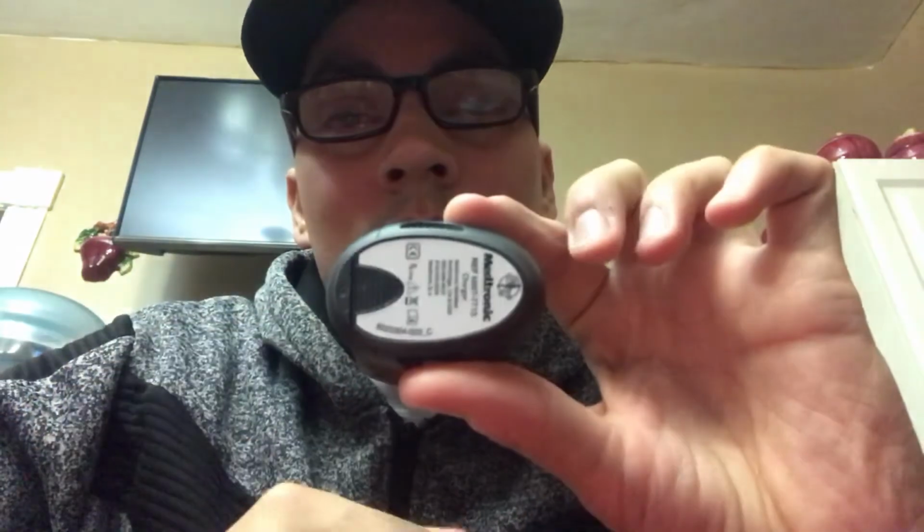So with your thumb you press and slide the back piece off, and there it is, revealing the battery. Replace the battery, take the battery out, put a brand new battery in there, and you slide it in again like so. Simple as that.